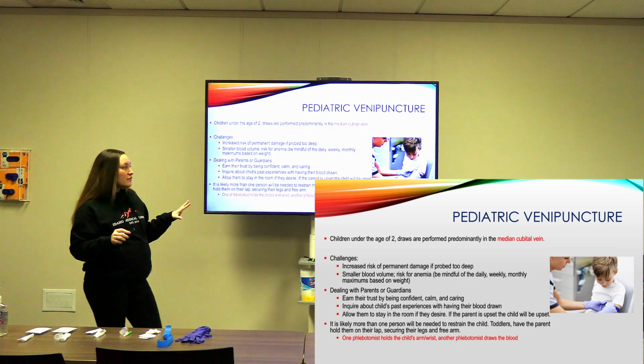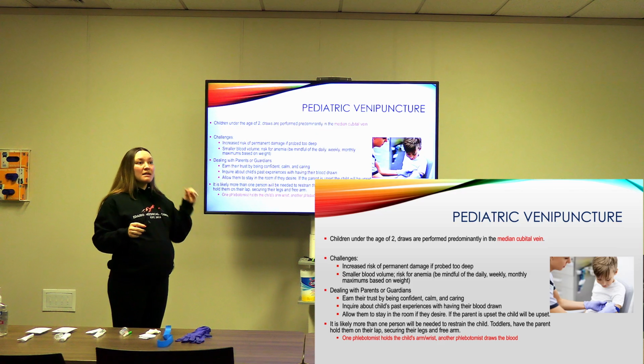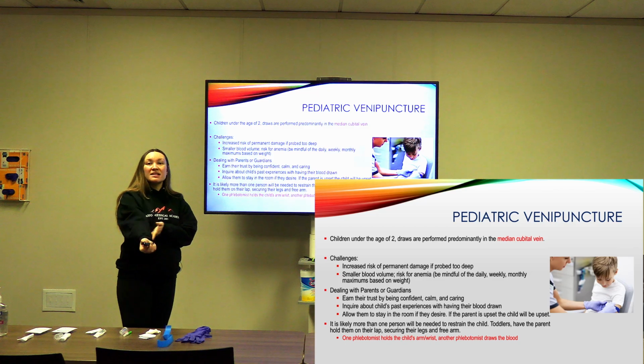Once we have everything set in place, you can move forward with the venipuncture as normal. It's going to be the same steps as it would be for an adult, just with a little extra assistance.